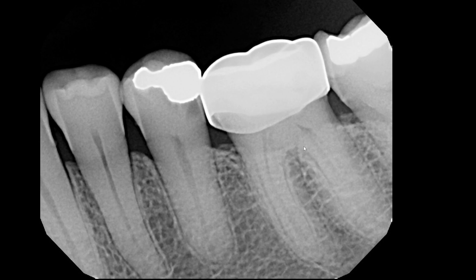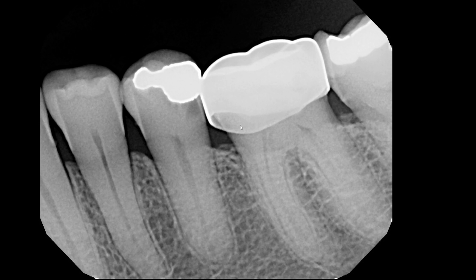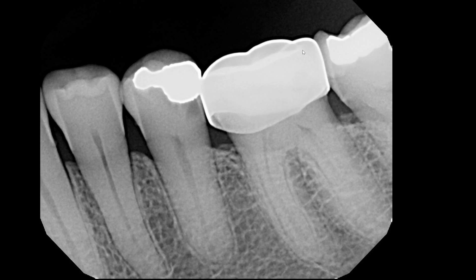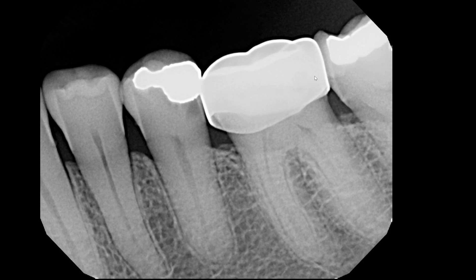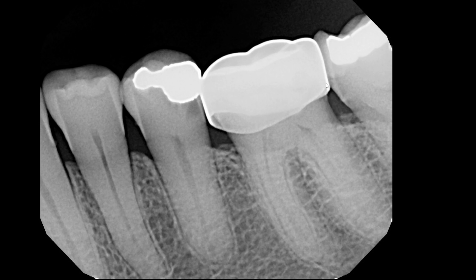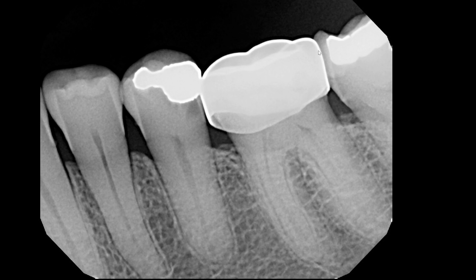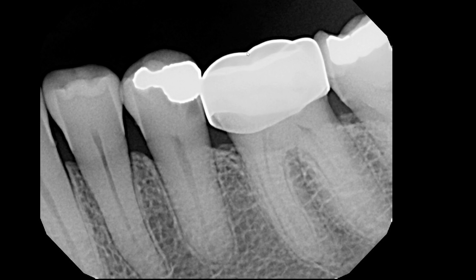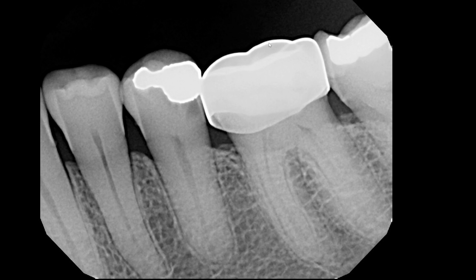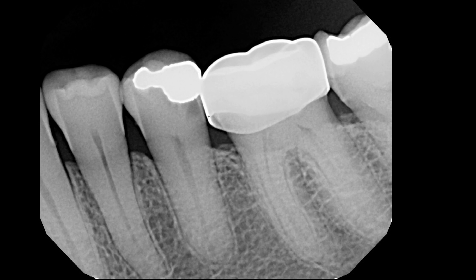What you're seeing is tooth number 19 with a radio-opaque, full coverage coronal restoration that's been placed. If you look at this, there are a couple of unique features we can address. First of all, the overall outline of the crown is very smooth and it lacks some of the anatomic details.